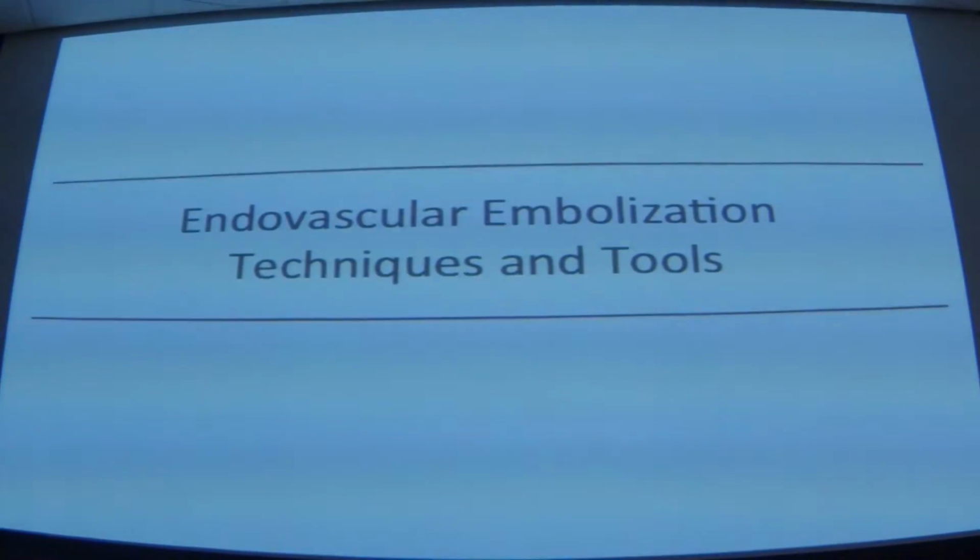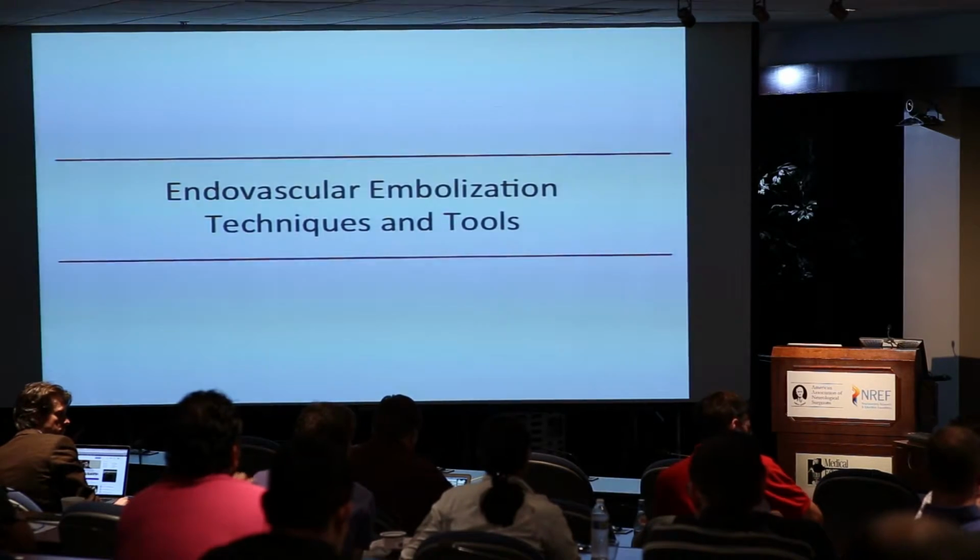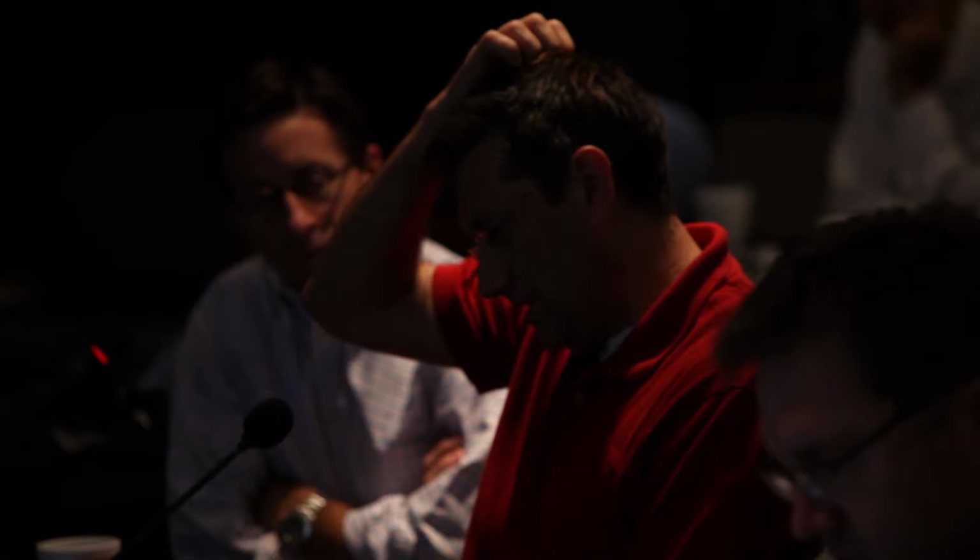So, to me, to go through the vein and start your embo in the vein and then reflux into the nidus and claim that you embolize the entire nidus, and then you do a control run from an arterial side, and if you don't see anything else, that means you're cured. I don't know. Is it all hype? Is it somebody trying to maintain his great stature in the world of neurointervention?